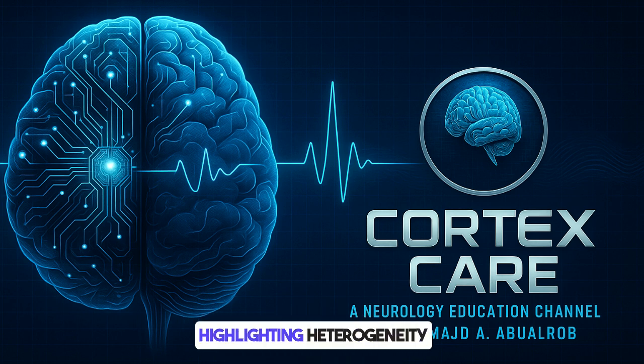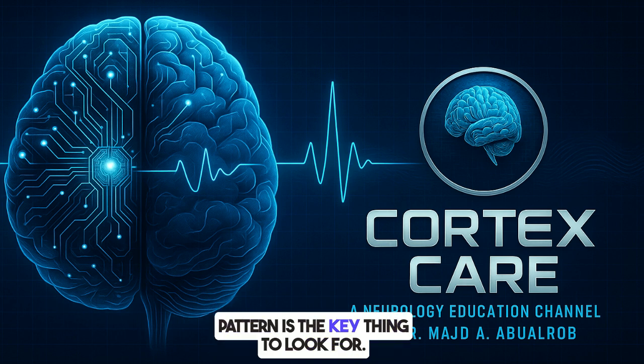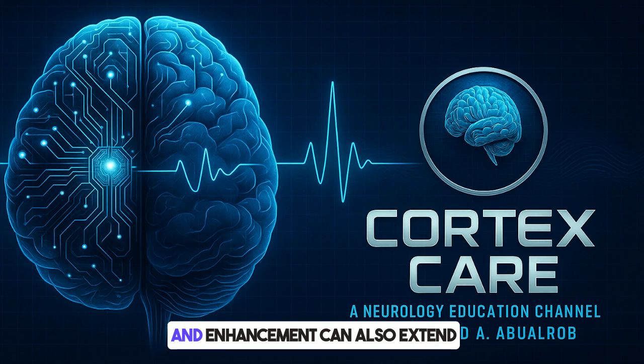It can, yeah, highlighting heterogeneity even within a single AE type. But that radial contrast enhancement pattern is the key thing to look for. It's a major clue, seen in about 50%. And enhancement can also extend into the brainstem, spinal cord, or affect the leptomeninges in nearly half of cases. Okay, wow. We've covered a lot of ground.